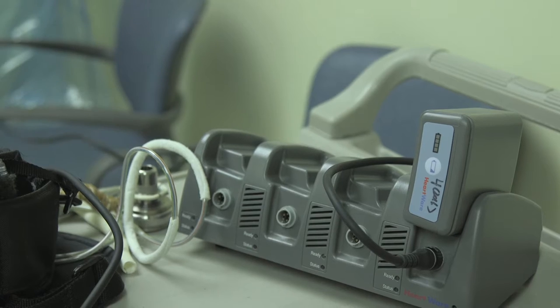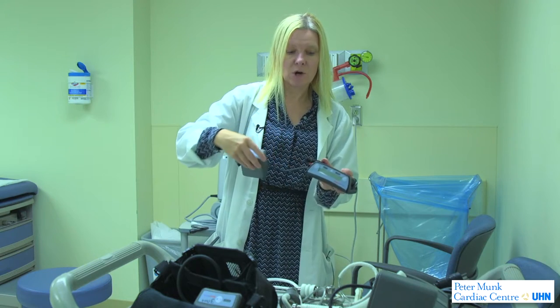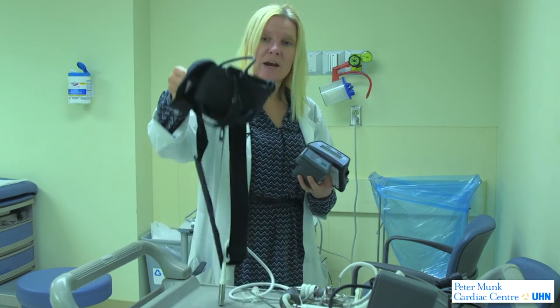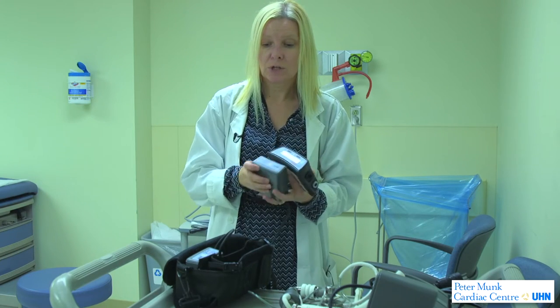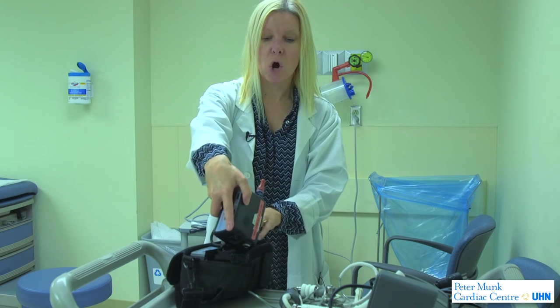The computer and pump need batteries to work. The patient will go home with several batteries but will wear two batteries at all times to keep the pump spinning the blood. They carry a little bag — each battery is one pound and the controller is about one pound, so the patient has to wear this three-pound bag with them at all times.